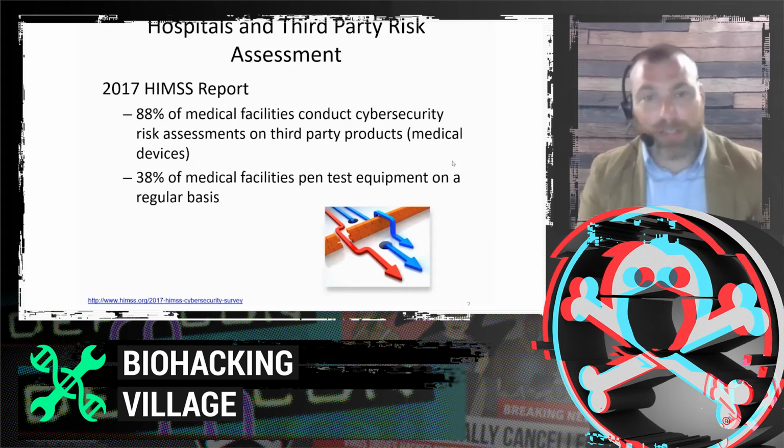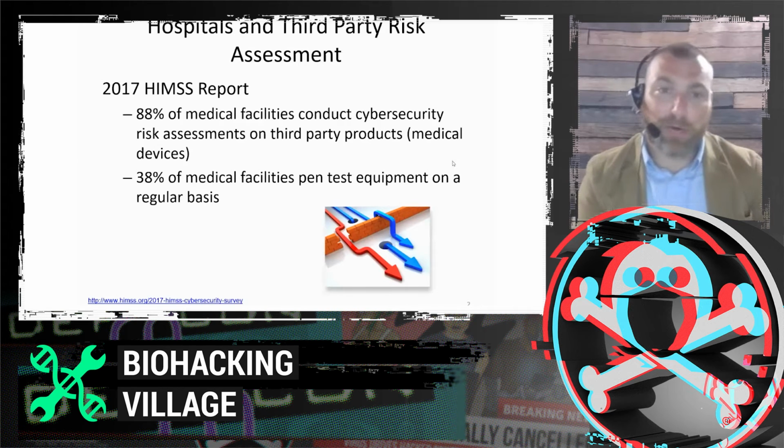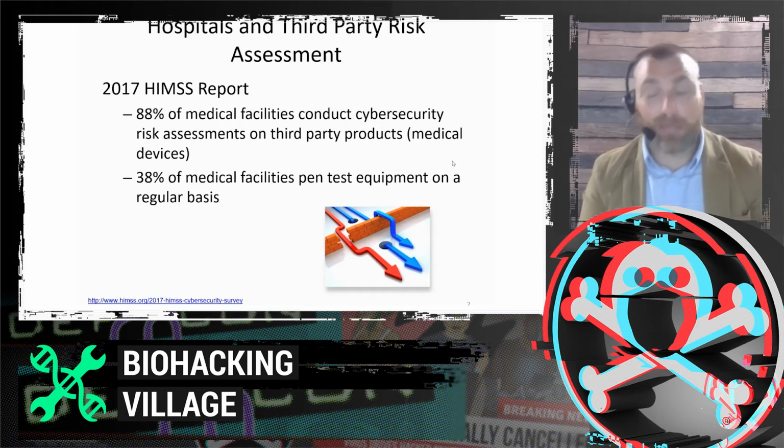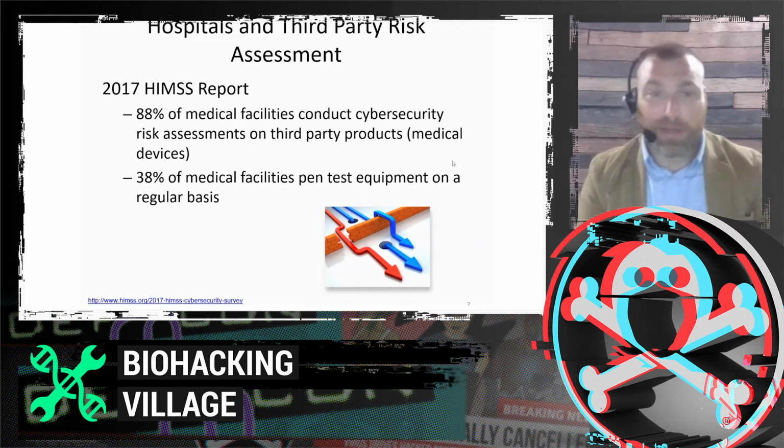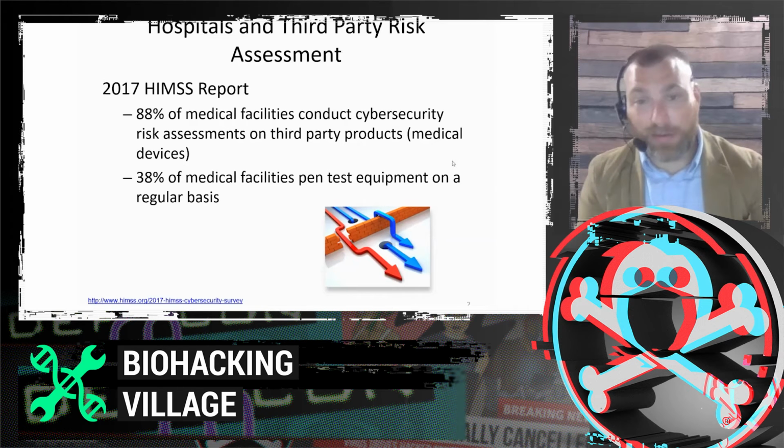So, again, just to set some stats and groundwork, if you're a hospital that's maybe not doing these third-party risk assessments but you're wondering what percentage of them do, back to the 2017 HIMSS study, which is a little bit dated, so it's probably even more so now: 88% of medical facilities are conducting cybersecurity risk assessments on third-party products, so medical devices and other products.